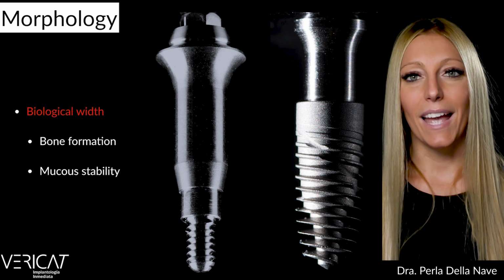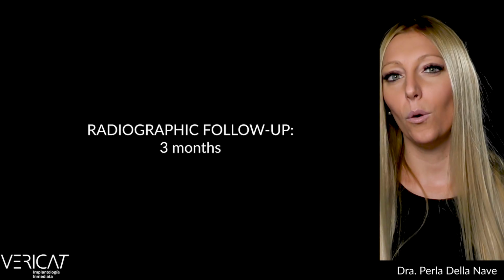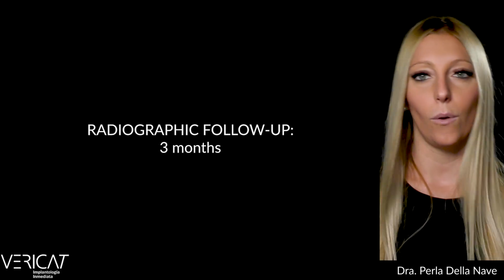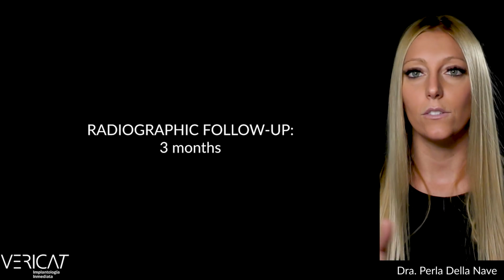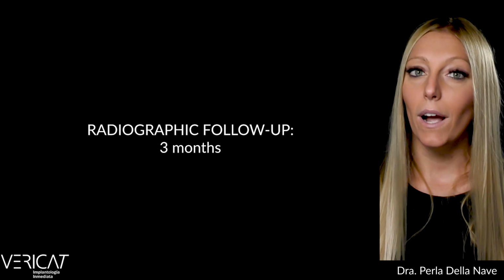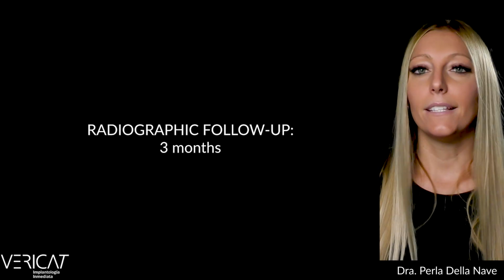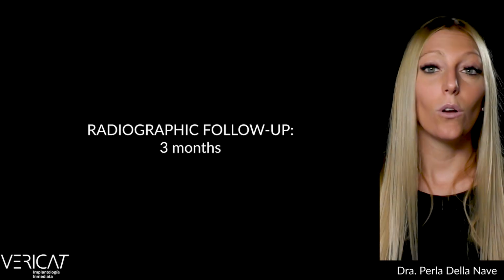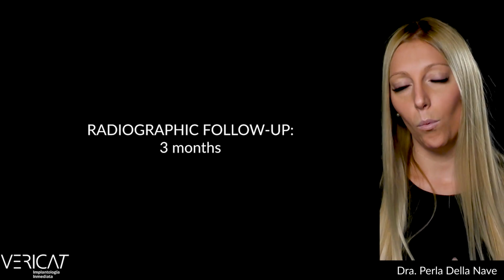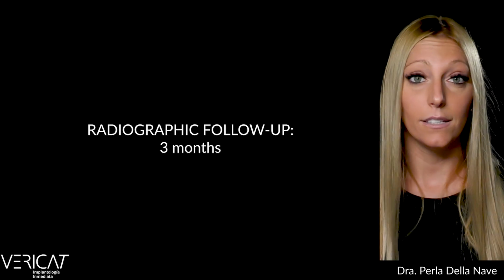So, after all we said, and in the last part of the session, let's take a look at some radiographs with the simple aim of observing the level of marginal bone after a variable follow-up period: 3 months, 1 year, 2 years, or 3 years. We will see only a few examples which represent an extremely wider case series whose results up to now are all similar. In some cases you will see orthopantomograms, in others intraoral radiographs, some of which are part of a prospective study started almost 1 year ago, so they were carried out with silicone bite registration for reproducibility reasons.